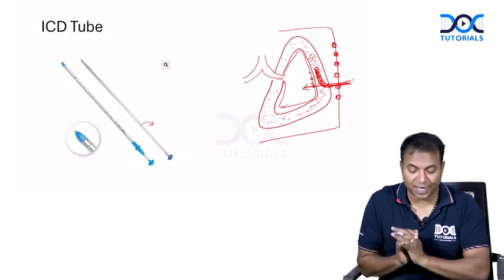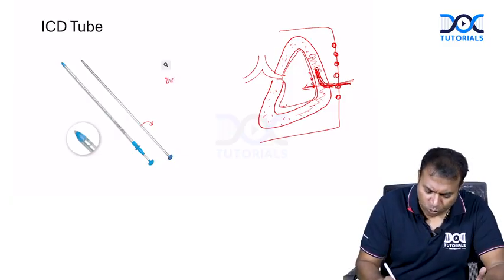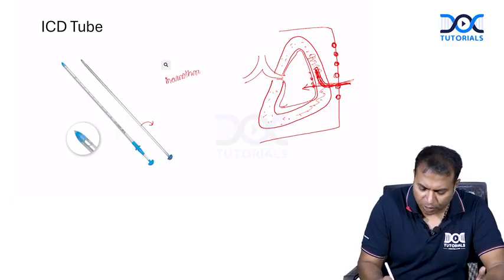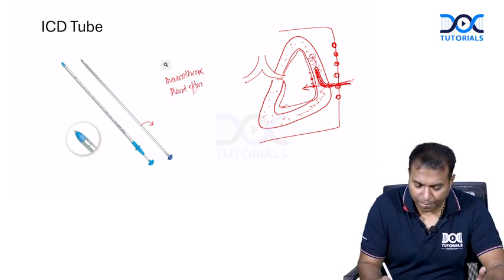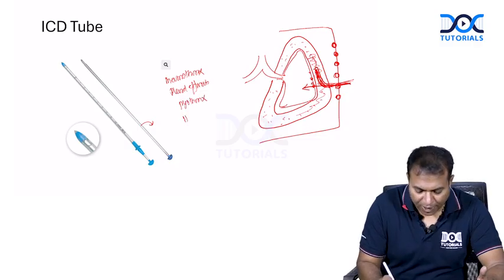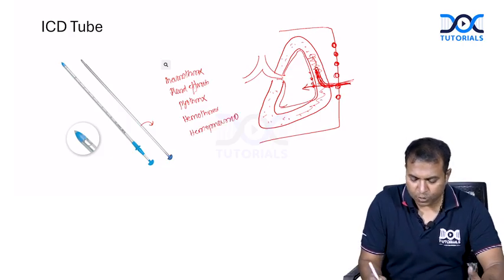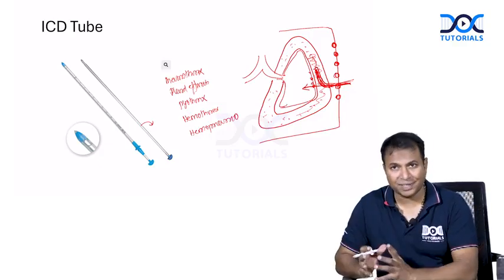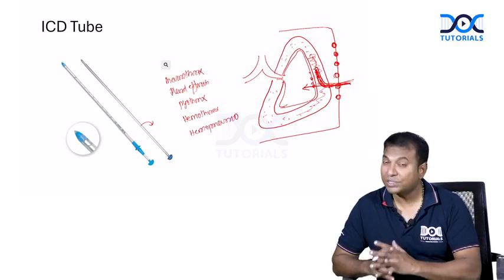So the intercostal drainage tube, I am going to insert in many conditions: pneumothorax, air in this space; pleural effusion, you can put this; pyothorax, pus in this place, you can put this; hemothorax, blood in this space. So in most of the problems in the thoracic cavity, especially collection of blood in this space, we can put this intercostal drainage tube. Please understand the basics behind this tube.